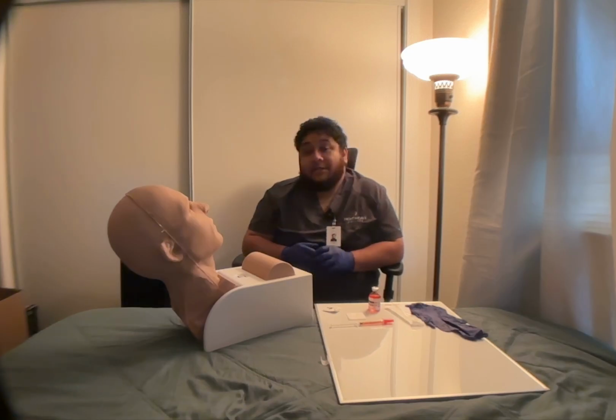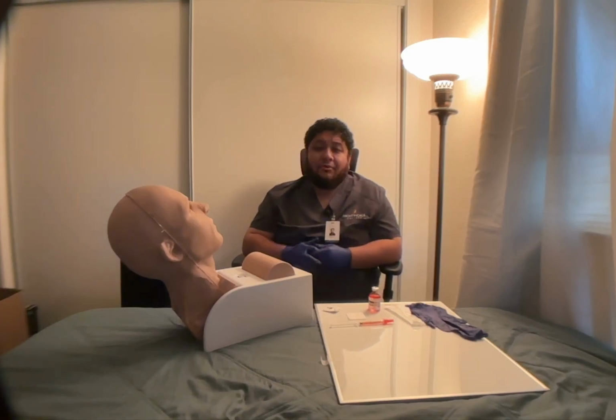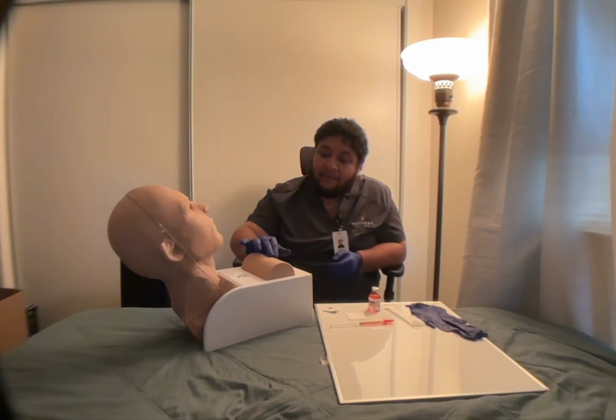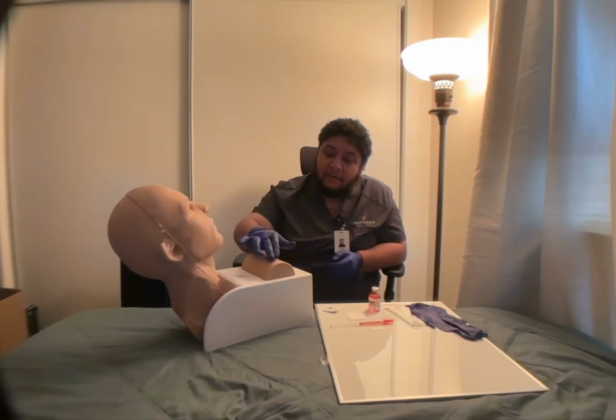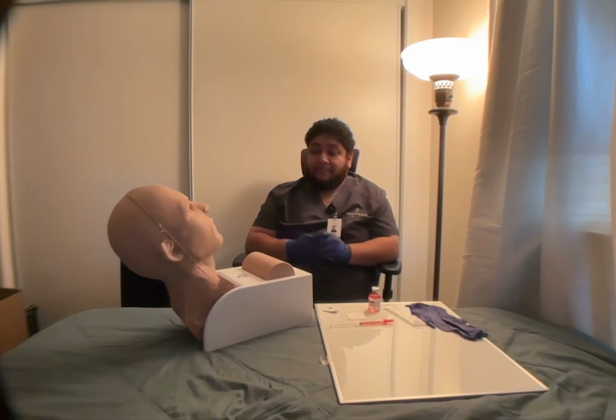So now I'm going to go ahead and inspect the abdomen for bruising, redness, swelling, or lesions. And then I'm going to go ahead and palpate for tenderness or masses. So I'm going to go ahead and palpate. Okay. Once that's done, checks out. It's a good area to inject the heparin.